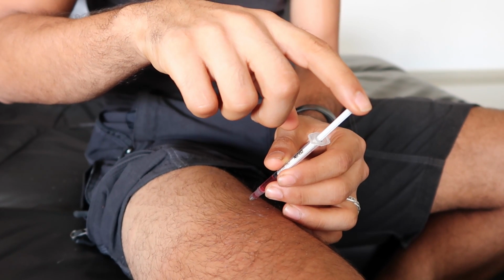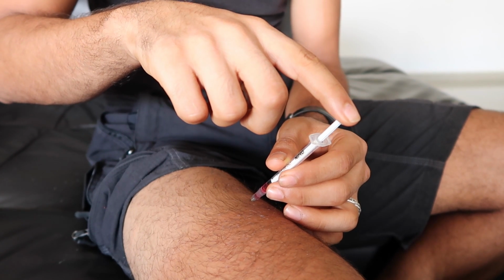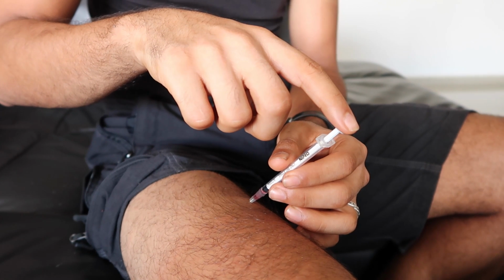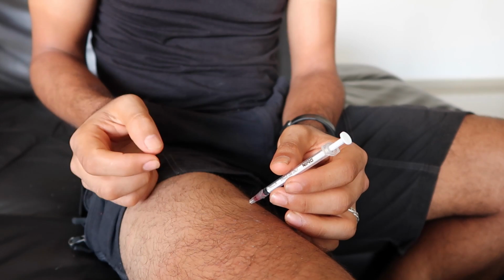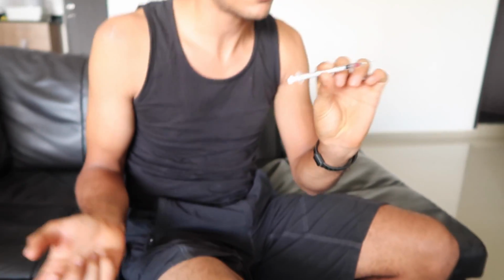As we are using insulin needles. See? Cool. And that's it, that's all done. And then gently pull it out. There you have it. B12 into the system. Raising my levels up a bit more.